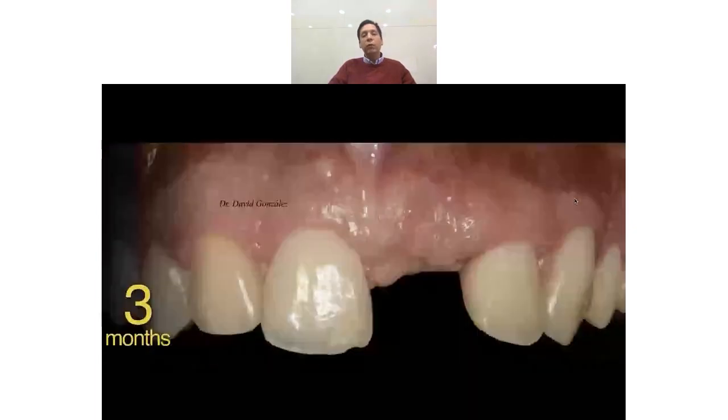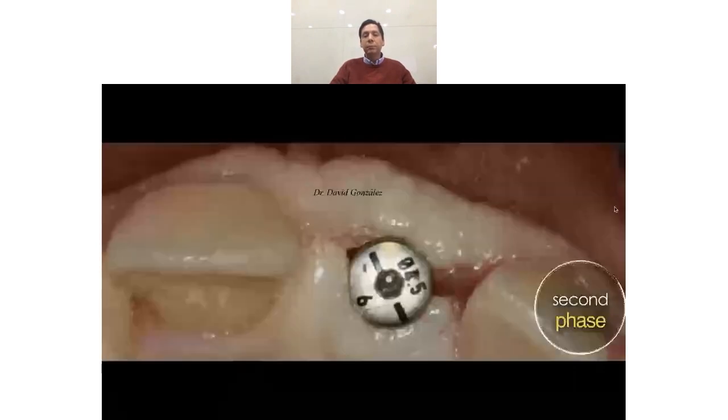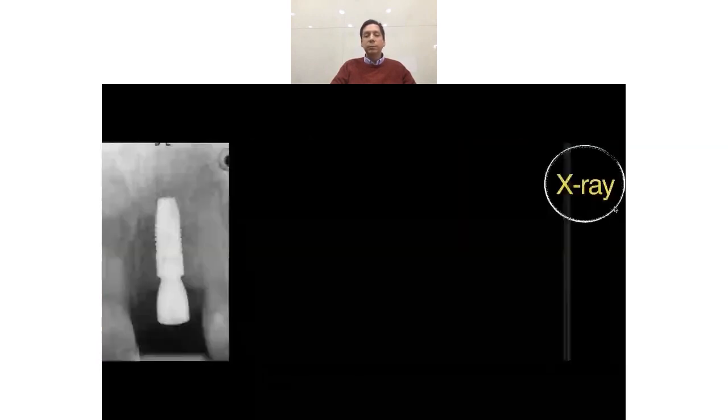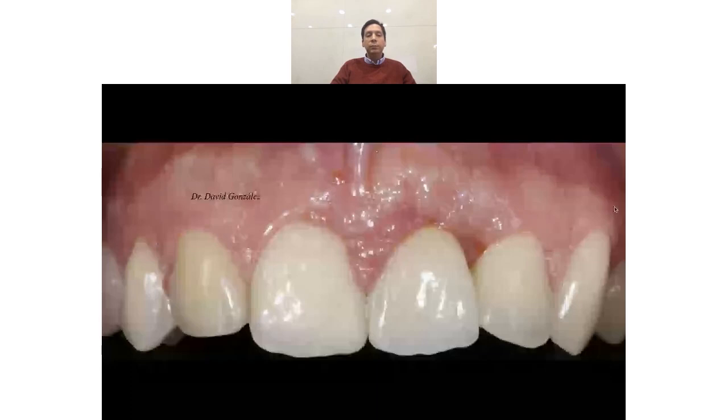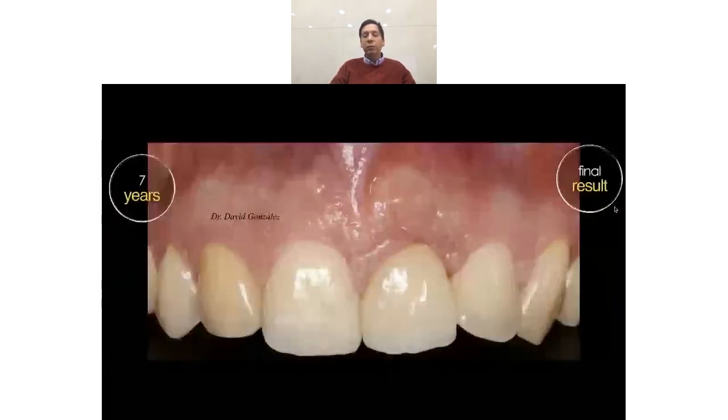3 months later, we're going for the second surgical phase. We see the nice aspect of the mucosa. Second surgical phase, we managed to remove the cover screw and put this transmucosal healing abutment. We see the X-ray, implant totally surrounded by bone. And this is the crown the very day we placed it. This patient didn't have a temporary crown. We went straight to the final crown.